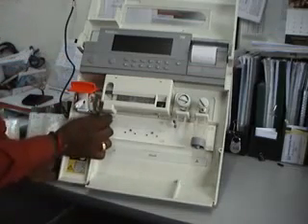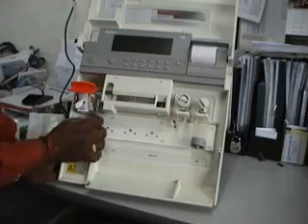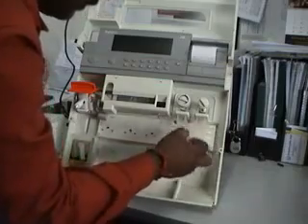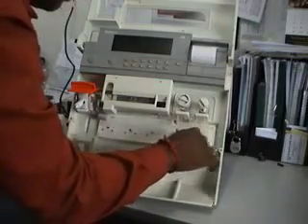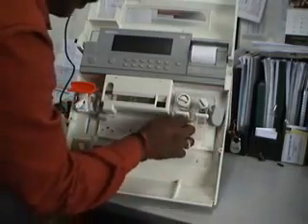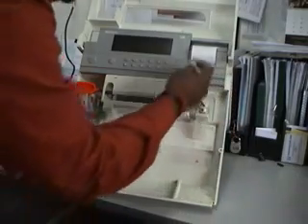Then there is one more connector — the preheater connector. And then the sample and reagent tubing, you have to remove those like this.